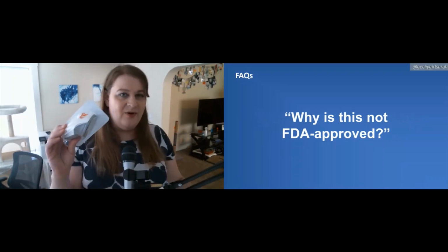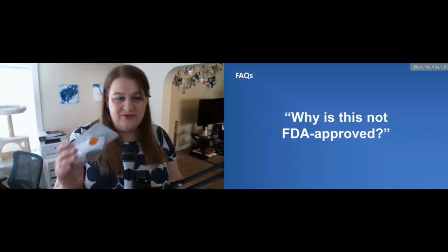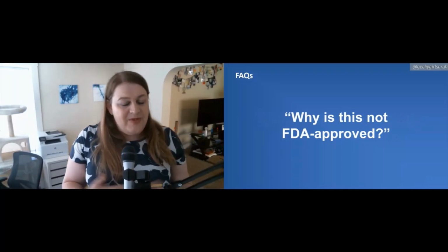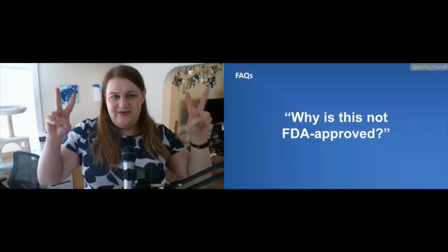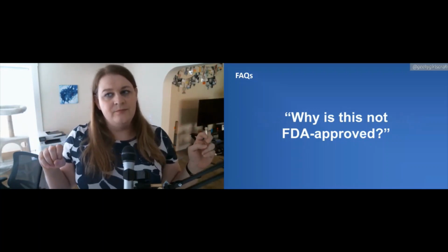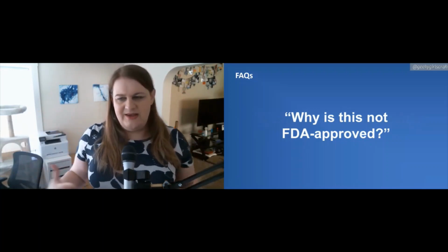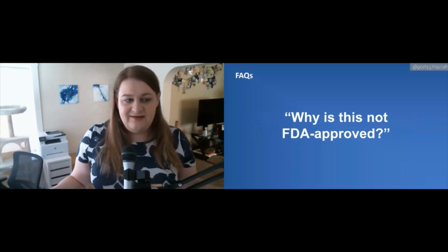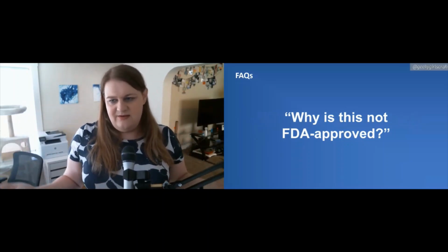And these are just normal prescriptions. Like my doctor had to write a prescription to get these things. So that part's FDA approved. But the system is essentially a self-experiment. Since I'm doing it onto myself, I'm not doing it to other people. I'm not selling this stuff. The FDA doesn't need to regulate it. So it's just not regulated.